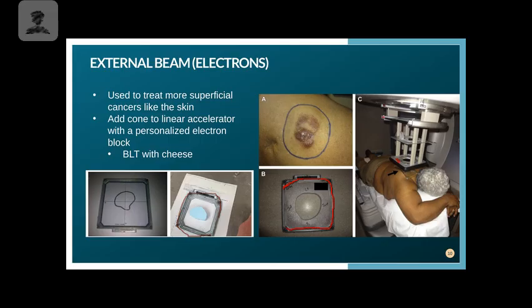So, I would say it's a handful of millimeters thick, but it gets heavy because of the metal. It gets really heavy. So then you're going to let it sit. Usually we would let it sit for at least 24, if not 48 hours to make sure that that liquid metal was good. And so then we would break out the styrofoam block from the center. You just kind of pull it apart in chunks. When it's gone, you get this. So it's what we call an electron block.